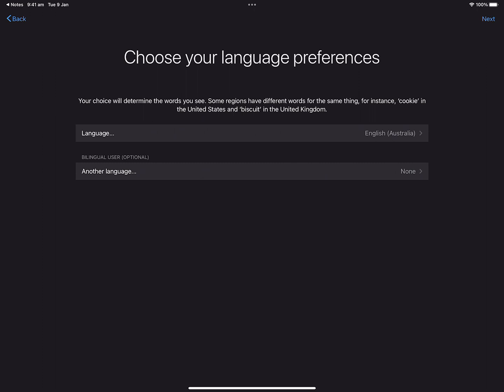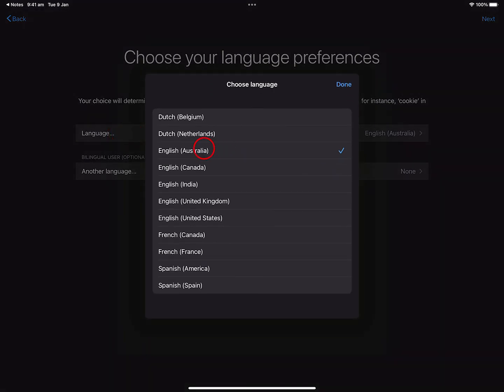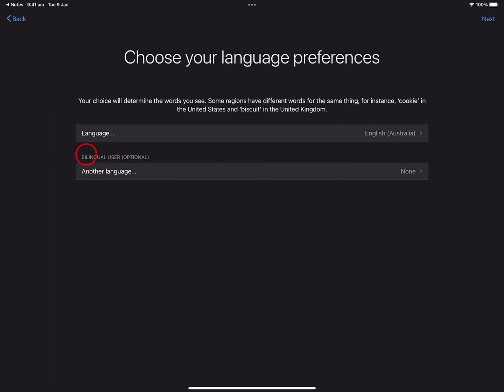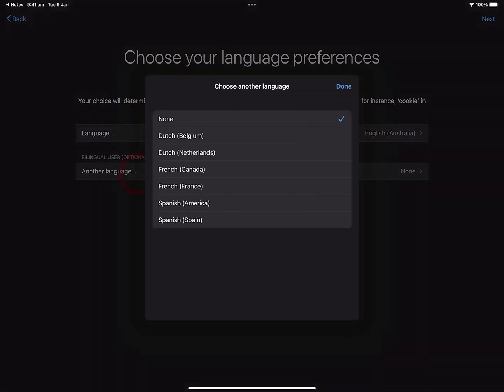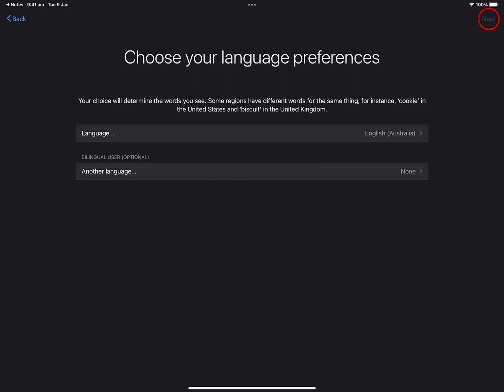Then I can choose my language preferences. I'm in Australia, so I select Language and it has English Australia chosen. But you should go ahead and choose the language and region for where you are. If you wish to create a bilingual user, you would add another language here. You can see Proloquo2Go comes in Dutch, French, and Spanish. Today I will just create an English user, so I will close this and then tap Next.